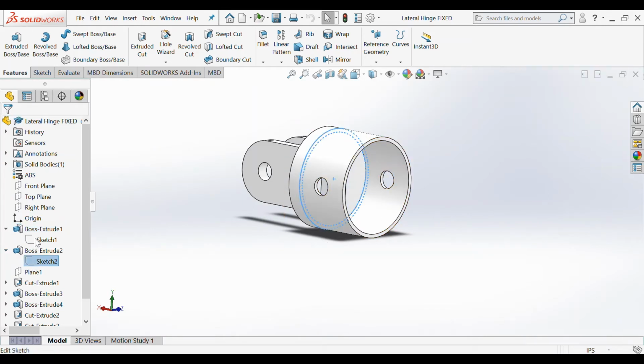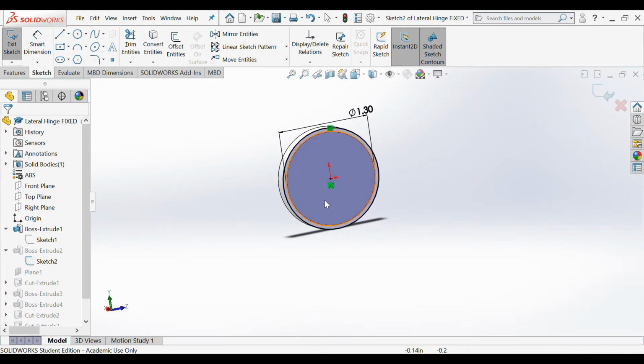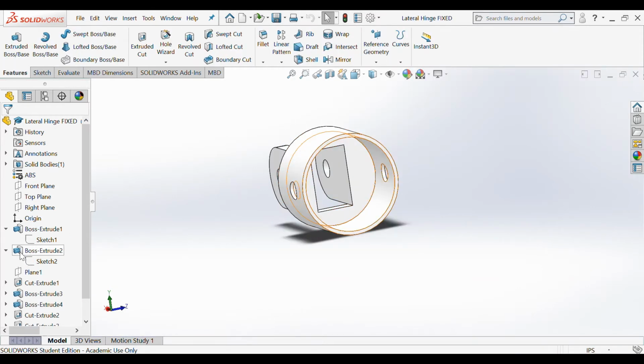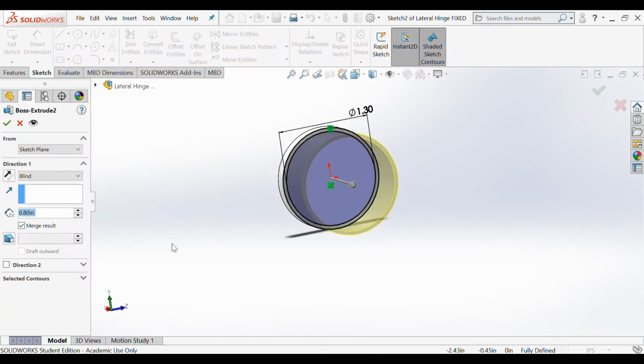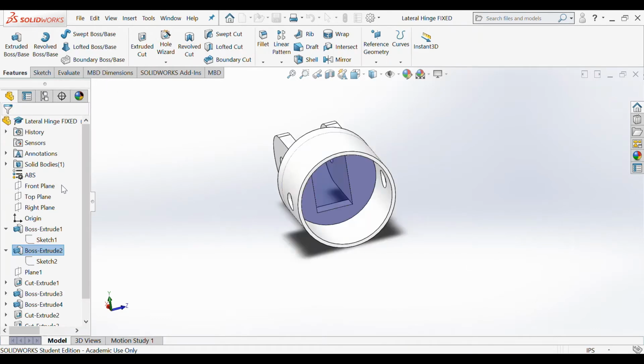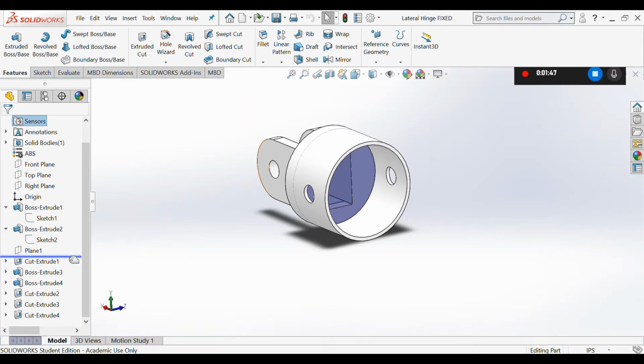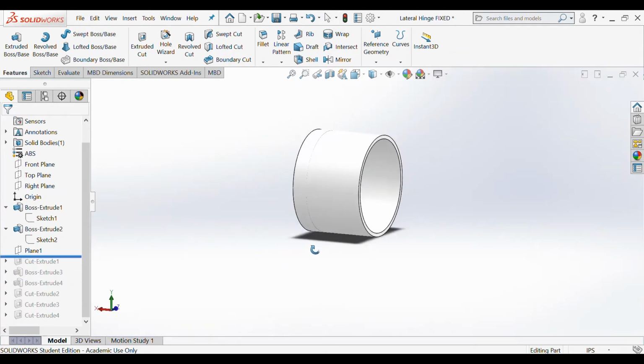Next, we drew a second sketch on top of our recently extruded circle from the center of the origin out to a diameter of 1.3. We then did another boss extrusion outwards, so the amount of area between the two circles were extruded out 0.80 inches blindly forward. Next, this is what we have so far.